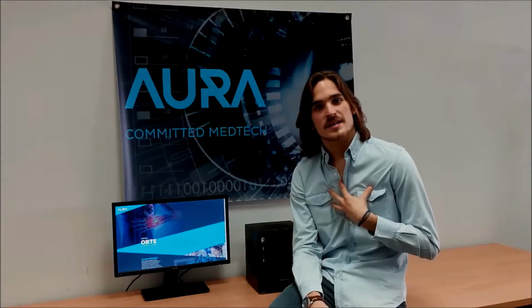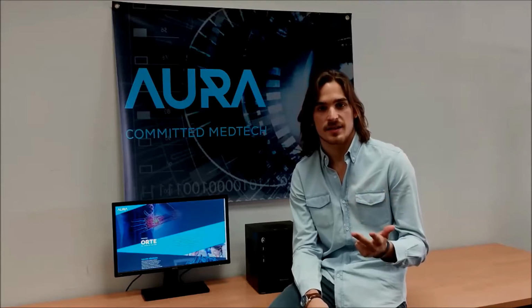Our ambition is to deploy ORTE everywhere needed, so patients can benefit from this technology. We aim to reach this goal through licensing agreements with distributors with global reach. Its price, versatility, and simplicity makes ORTE unique in its class.